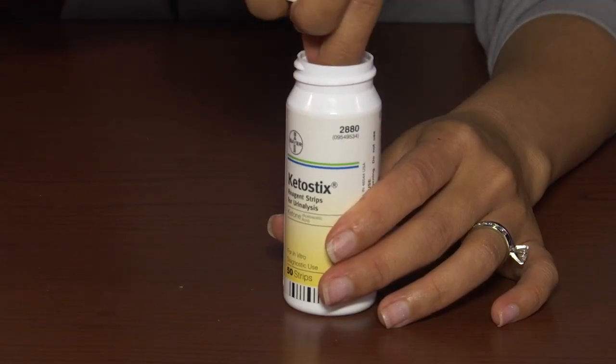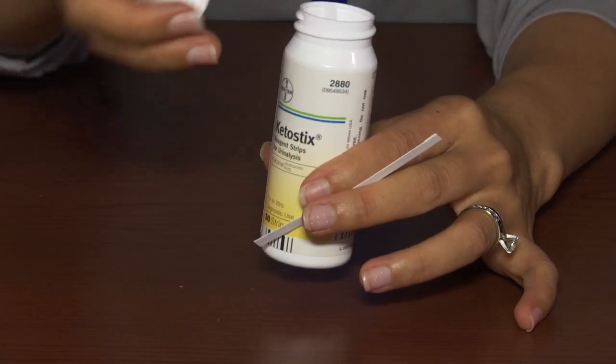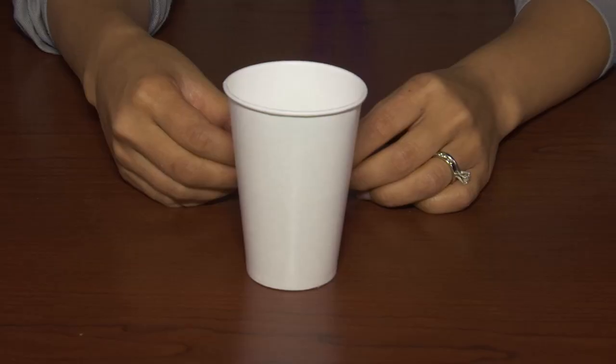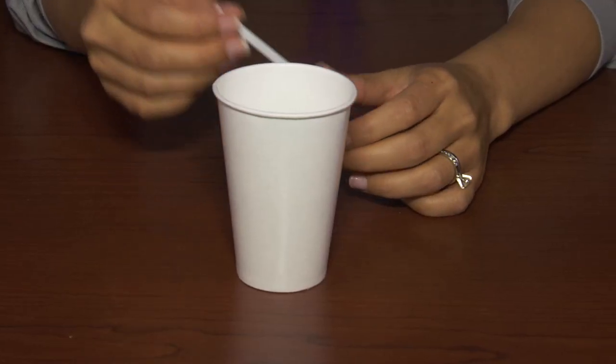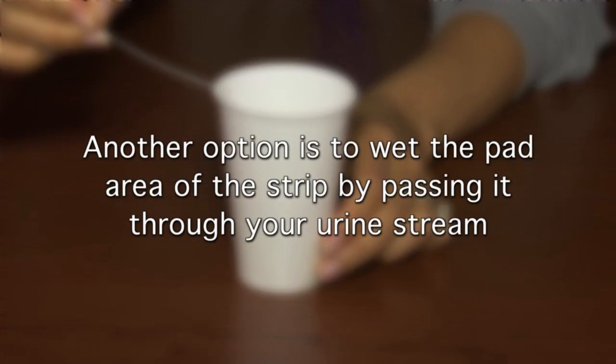Open the bottle of urine test strips and remove a test strip, then immediately close the bottle. Dip the test strip end in fresh urine and remove immediately. You can also wet the pad area of the strip by passing it through your urine stream.